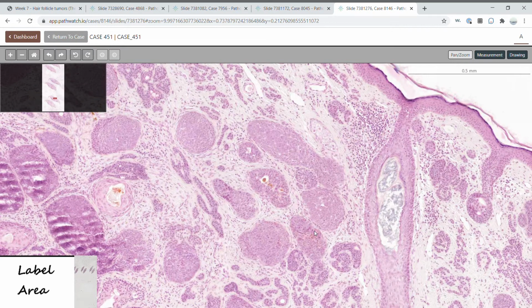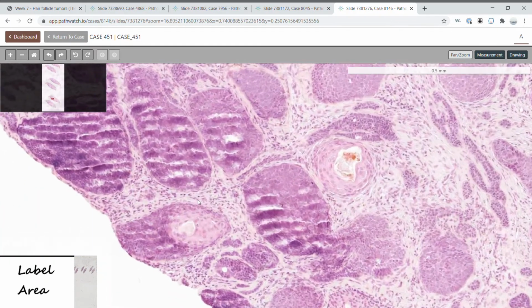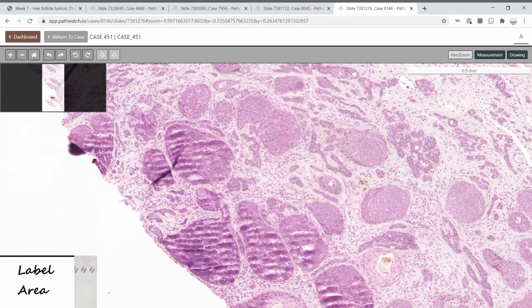Finally, we will talk about trichoblastoma, and these are multiple blue islands in a fibrotic stroma. Trichoepitheliomas and trichoblastomas represent the same spectrum of disease. When you see multiple blue islands with a concentric fibrous stroma, then this would be considered a trichoblastoma. Trichoblastomas are associated with nevus sebaceous.